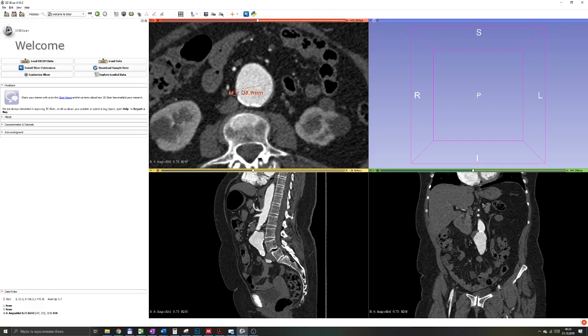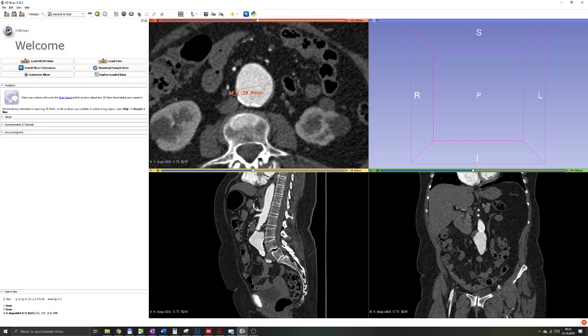It automatically makes a measurement and shows you the name of the measurement. Right here it's M1, and the length, or the diameter of the structure.